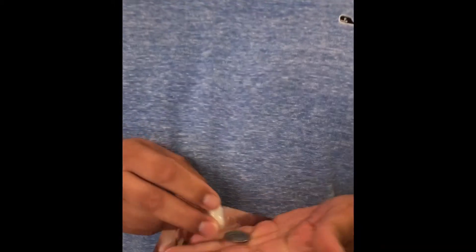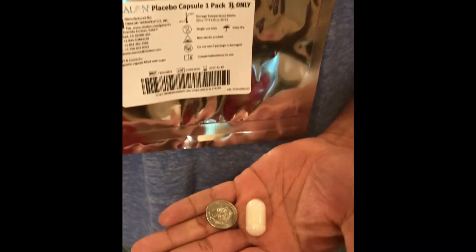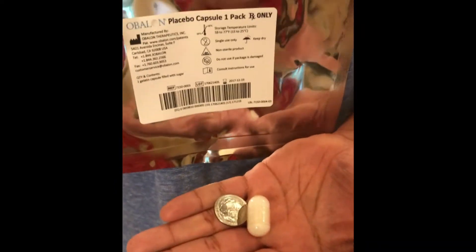Here's the placebo. You can see how big it is next to the quarter. In order to swallow the balloon, we've got to swallow this to make sure that you are a candidate — able to swallow this with water. Although they do say it's a little different, this is about the same size.